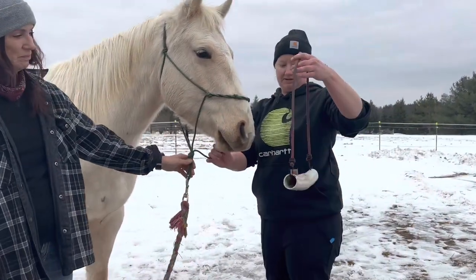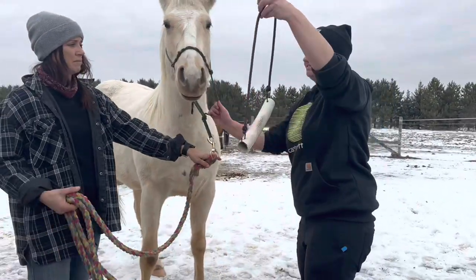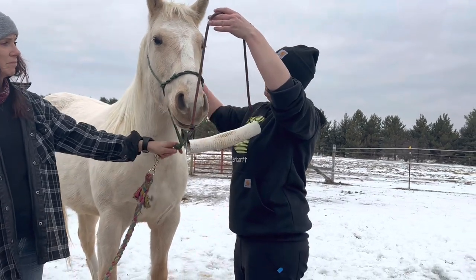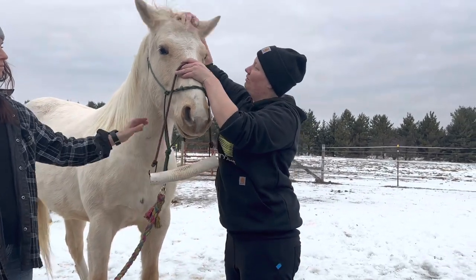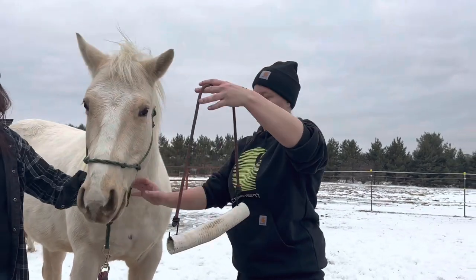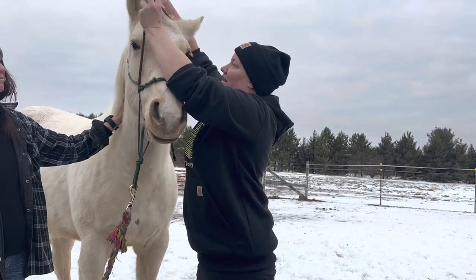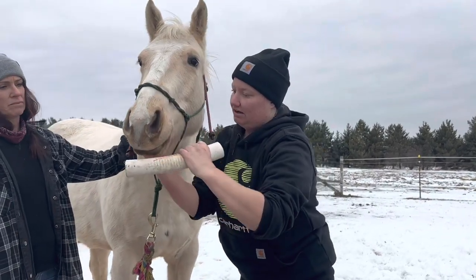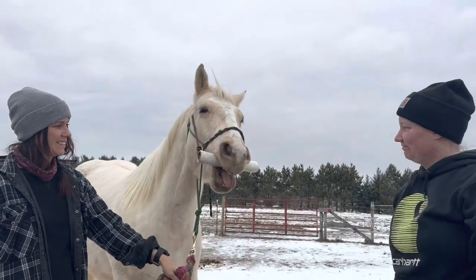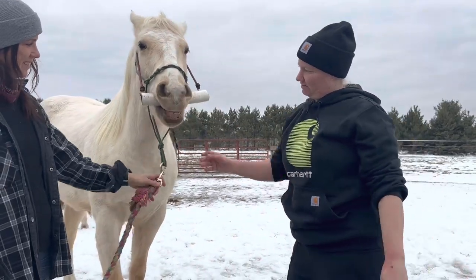They're called caps. And he's got a really loose one. Oh, he's never had this on before. It's his gag, called the gag, like we explained before. And he's just a little wary of it. So we just established a starting point. Now he's pretty good with it. Good. There. And his eyes are relaxing. Now it'll go in his mouth just like a bit. Good. So we'll give him a minute before I start really messing with him.